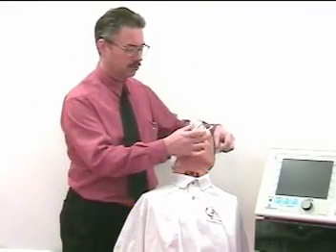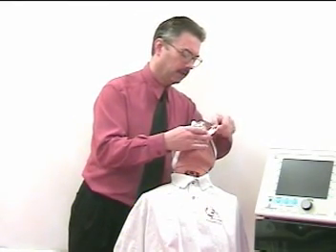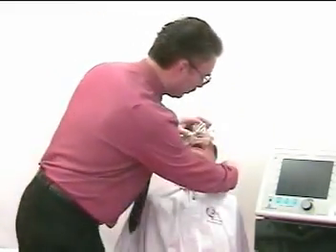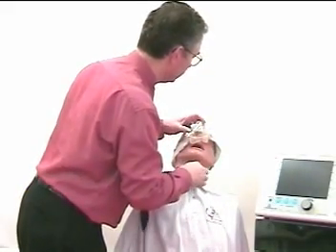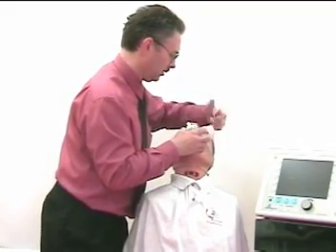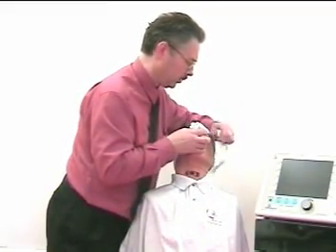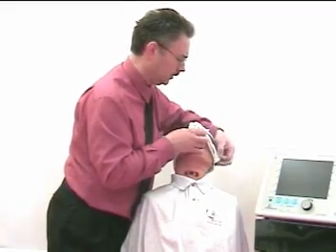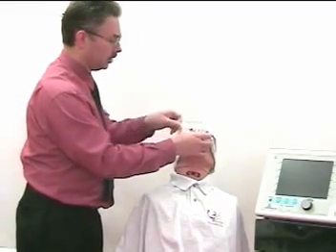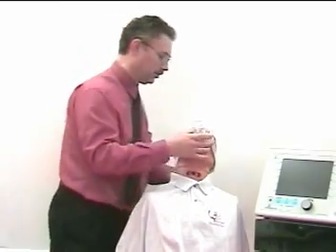Place the mask on the patient's face, bring one side around, and these are Velcro. Adjust the mask and bring the bottom strap around. You want to gently, at this point, place it on the patient's face, holding it in place. Reassess the bonnet, adjust the straps so that you have an even positioning on the patient's face.